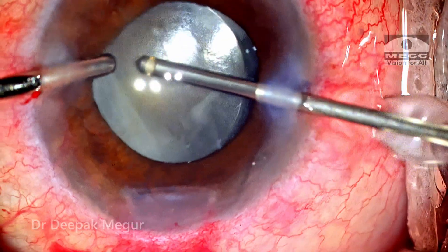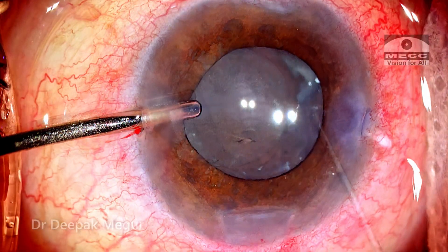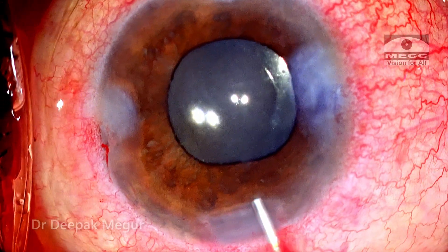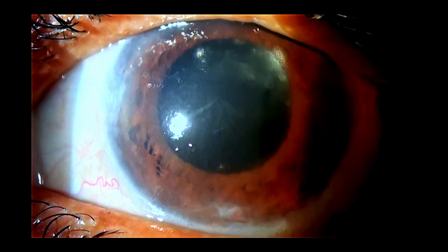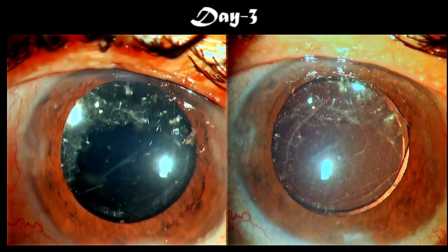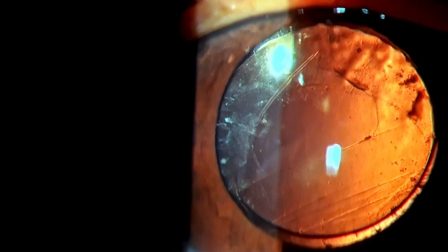Once all the OVD is taken care of, the lens is re-centered and diluted triamcinolone acetonide is used just to confirm that there is no vitreous fibril remaining. This triamcinolone acetonide also helps in controlling inflammation in the early post-op period. The lens looks well centered — time to close. The side ports are hydrated to ensure the chamber is maintained. On the first post-op day the pressure was still 25 and the cornea steamy, so the patient was continued on anti-glaucoma medication. Three days later the eye looked good and the patient was doing fine.